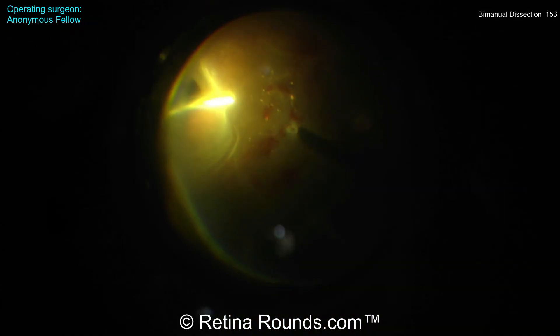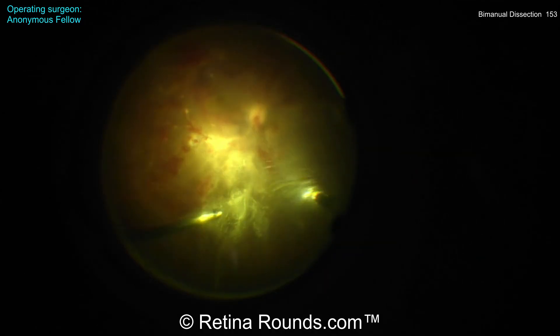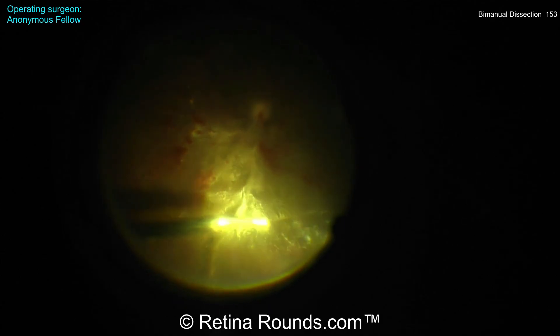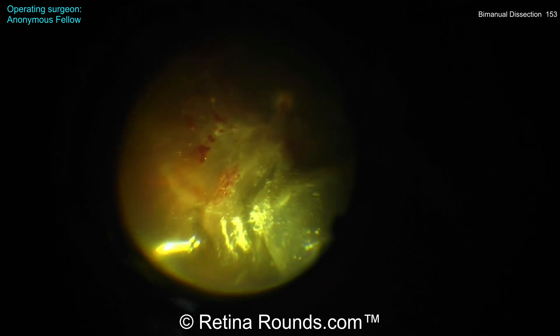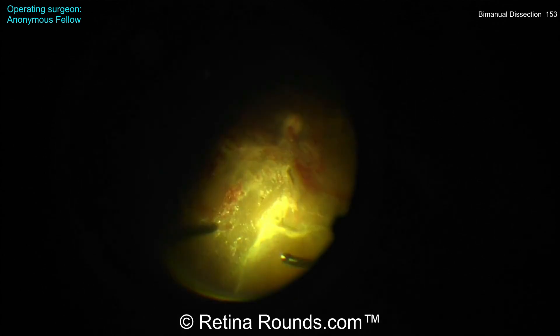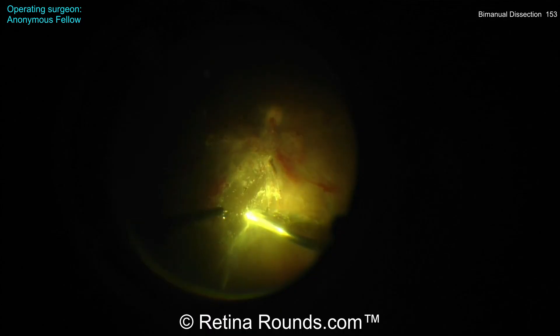Now once all those membranes have been removed, some peripheral shaving is being performed. I like the use of scleral depression here to make sure that as much of the peripheral vitreous is trimmed back as possible. You can see there's quite a bit of residual vitreous in the superior retina here. The retina is highly mobile, so you do want to adjust some parameters of the vitrectomy system to decrease the risk of an iatrogenic break.